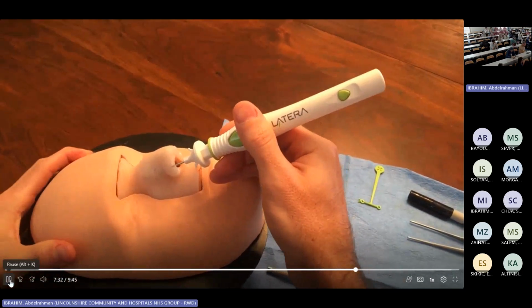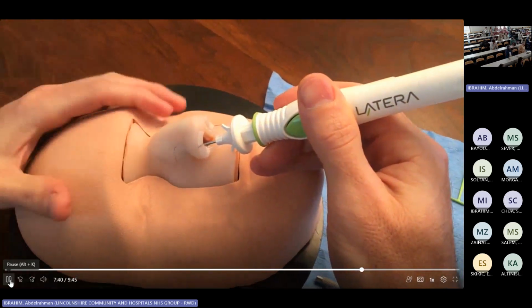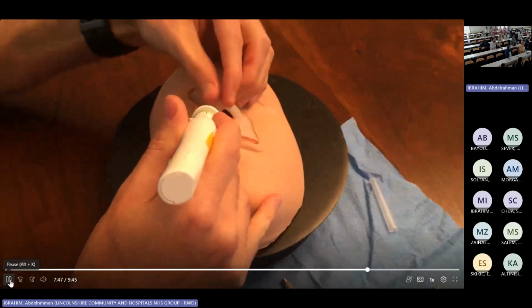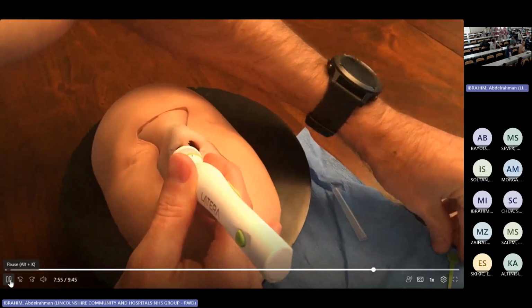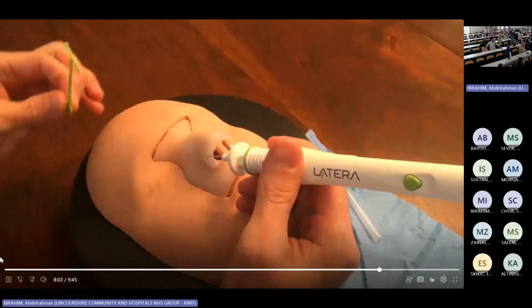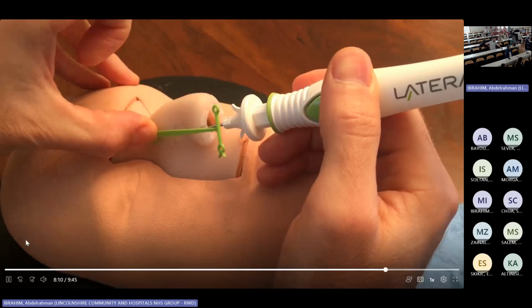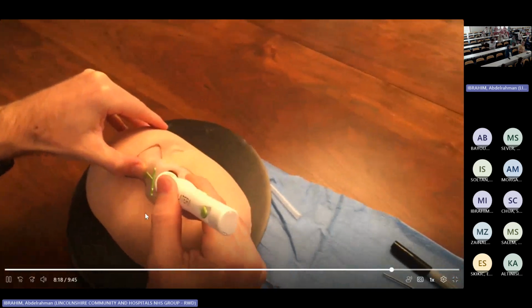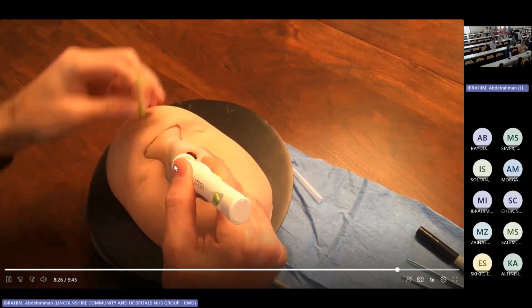So that is push. So there's two things that we need to check here. We need to check that the fork orientation features are parallel to the nasal bone. And the second thing is that we need to check that the orientation of the device, this angle, is parallel to the nasal bone. Another way that I like to look at this, for training purposes, is the positioning guide. So the angle of the lateral wall is always slightly different than the angle of the nasal bone. You take your positioning guide and put the distal in and hold it against the nasal bone. That gives you the angle that your device should be at the point of deployment. So you can align your device with being parallel to the nasal bone. So that's a good position right here.